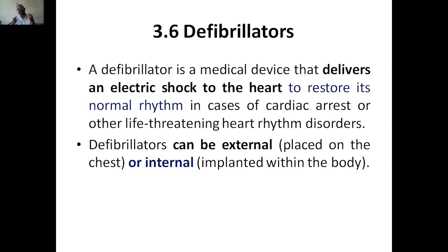We can deliver a huge electric shock so that the heart restores its electrical impulse capacity, that means the normal rhythm.